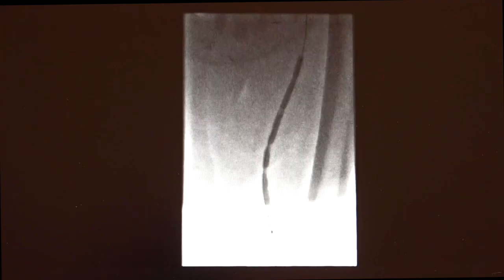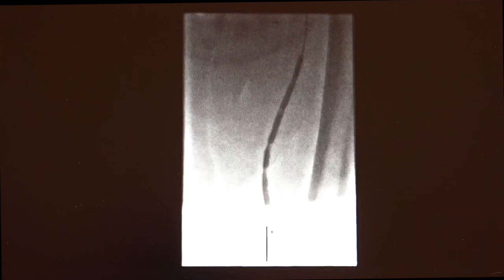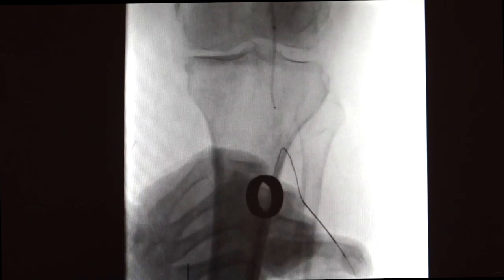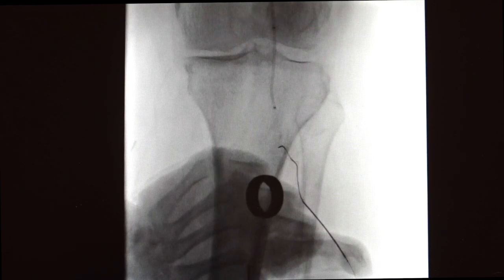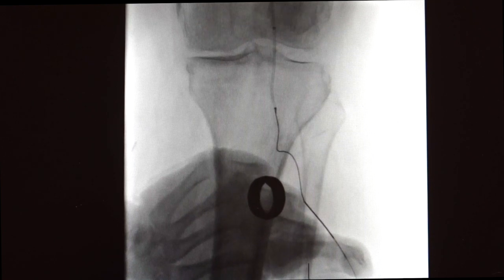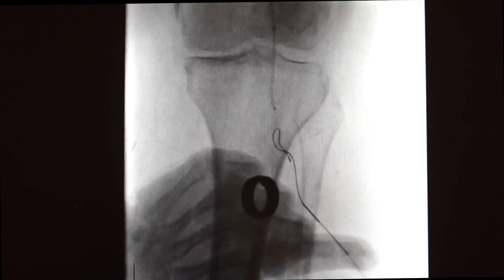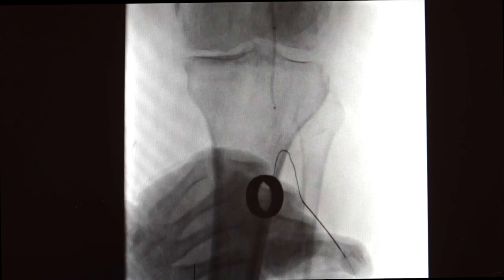We first started by addressing the SFA inflow issue, using a 5 by 120mm Sterling balloon to balloon the SFA via the left brachial over a Workhorse wire. Our initial result didn't show a great deal of difference but there was still flow. At this point we determined we needed to get all the way down to the popliteal; however, we were having difficulty advancing equipment from the brachial, and there was severe disease requiring good support.